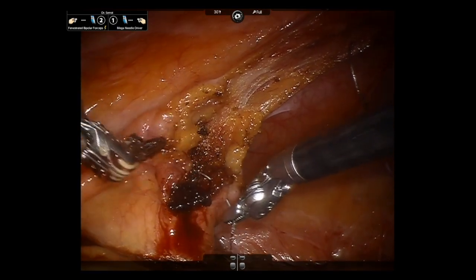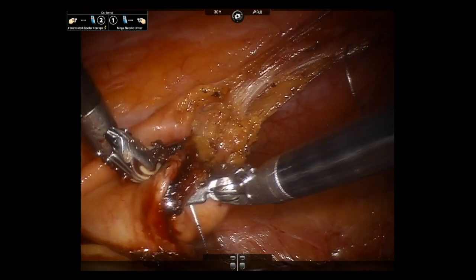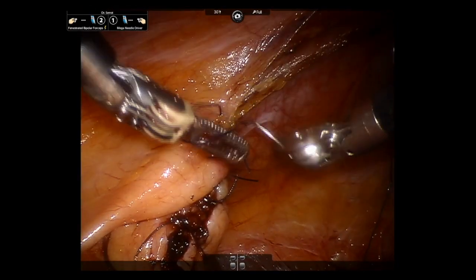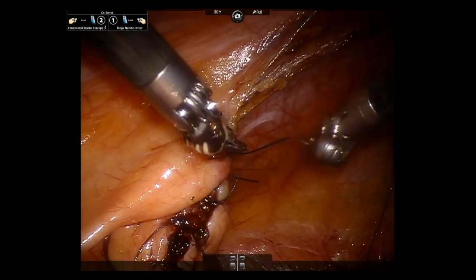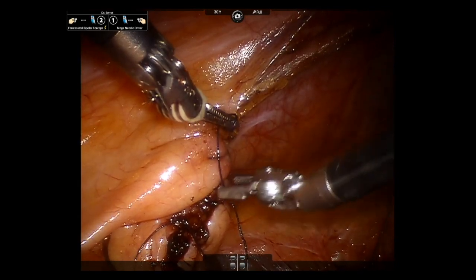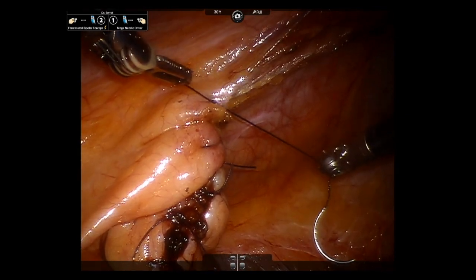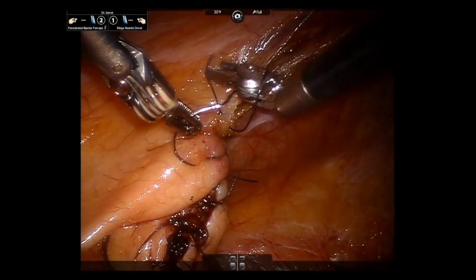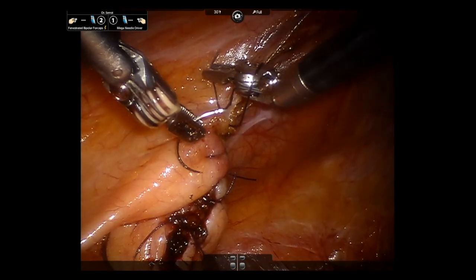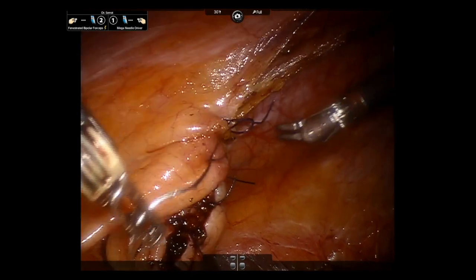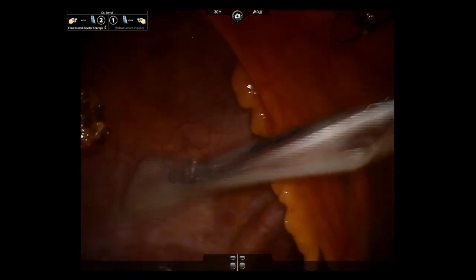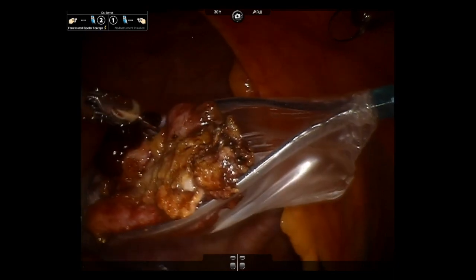As no methylene blue had been noted during the surgery and no signs of entry into the bladder had been found, the peritoneum was closed using a single layer of interrupted Vicryl sutures. An additional step not pictured in this video was the filling of the abscess cavity with saline to ensure there was no communication between the pneumoperitoneum in the abdomen and the abscess cavity. The final step was placing the specimen in a retrieval bag along with the calcification and closing the port sites.